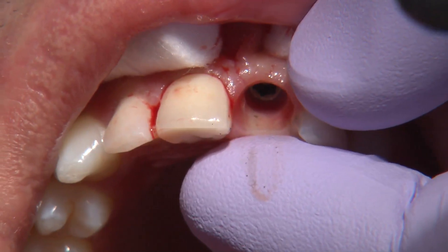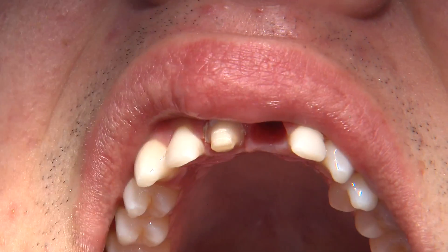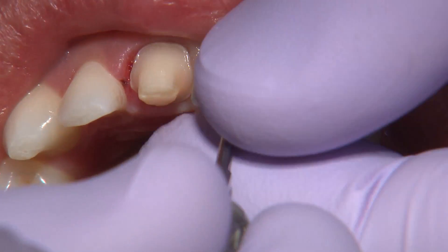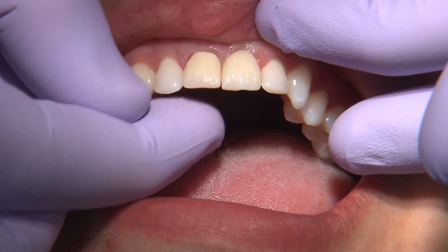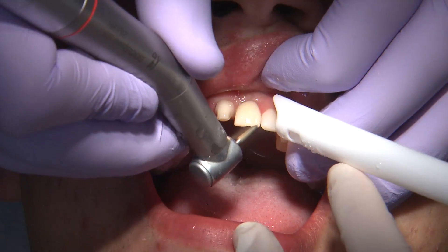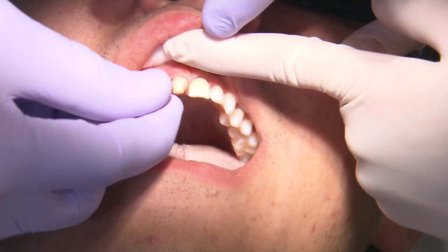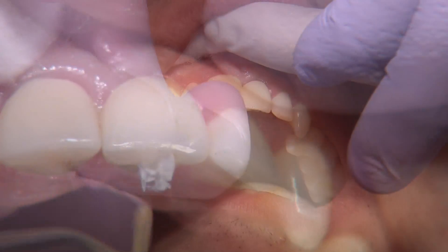The patient comes back for delivery of the final restoration. I remove the temporaries and seat the final restorations to try them in, making sure they meet the aesthetic requirements of the patient and our standards for function. The crossbite is going to affect the final outcome and the patient is aware of that. In the anterior, the patient is almost edge to edge, and going posterior he is in crossbite. We get the occlusion adjusted and deliver the final restorations — the crown for the natural tooth is cemented and the crown for the implant is a screw-retained crown, using different techniques for each.